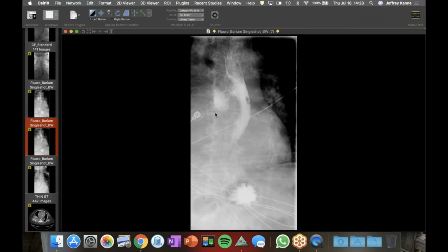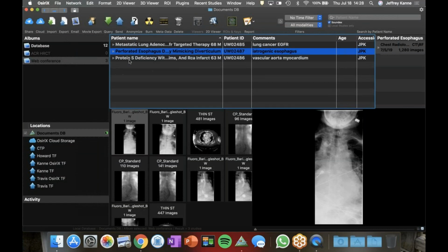And even the GI radiologists were a little confused because without access to the previous imaging, it looks like just a diverticulum, sort of a pulsion diverticulum where you'd expect to see one, or because there was no scar around it, and some motility. So a little complication there.